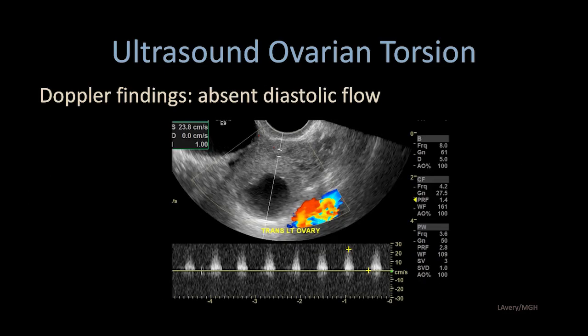Here we have absent diastolic flow — that's another possible finding with ovarian torsion. As the pressure increases, you may lose that low portion of the cardiac cycle. This is a high-resistant waveform.